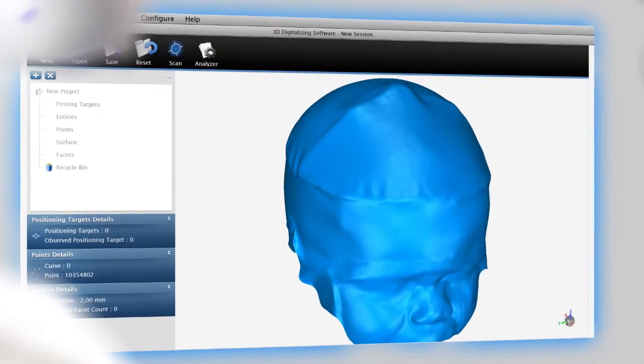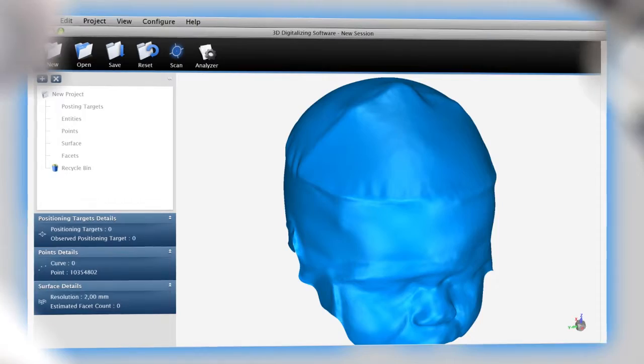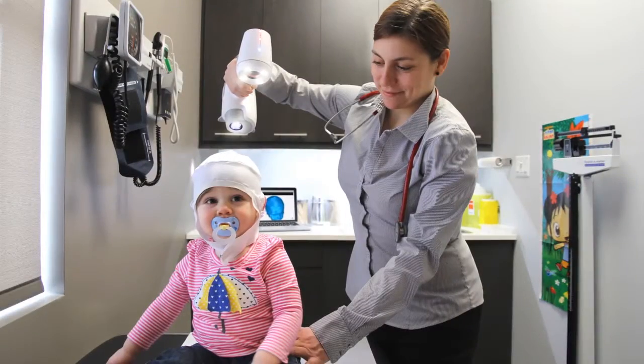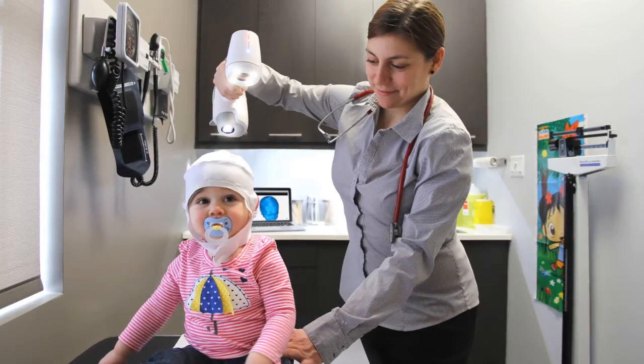Thanks to the API that we have developed, the Healthcare Partner 3D Scanner can be seamlessly integrated into your own 3D scanning solution. The 3D scanning process is clean and non-contact, which means that your patients have a positive and comfortable experience.